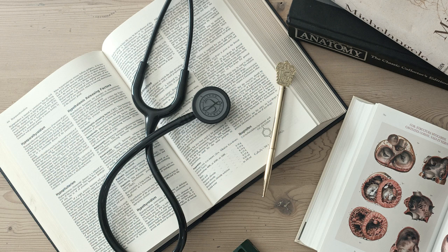Exactly. You might be tempted to dismiss this as physiological bradycardia like you'd see in a very fit athlete with high vagal tone whose heart is just incredibly efficient. However, the critical distinguishing factor here is that in pathological sinus bradycardia, the PR interval is often normal, despite the very slow heart rate. Why is that significant?